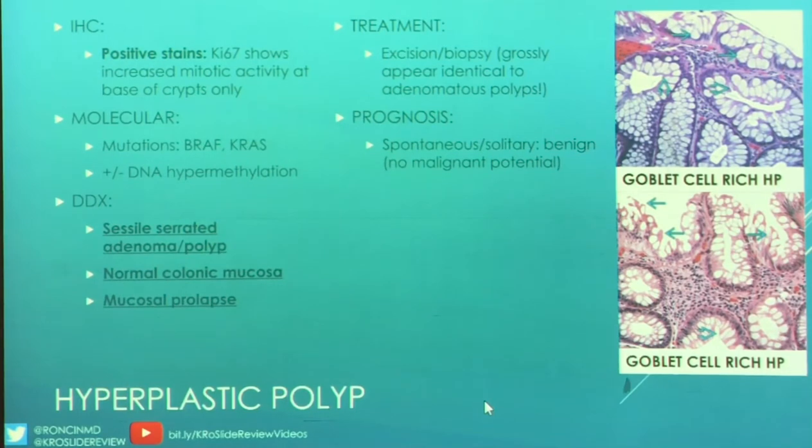Again, these are spontaneous. They're relatively benign. If they're associated with things like your familial disorders, which again we have the huge list of associations, then those can be associated with increased risk of malignancy.